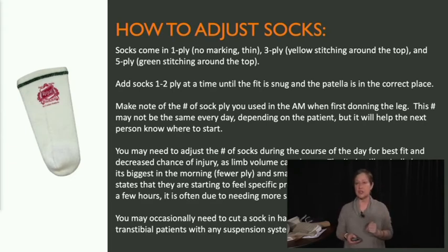This kind of gives you the overview, and you might have your own sock management handout for patients. I would suggest that you get the handout from your local provider, because the patient comes to you for their outpatient therapy session, and you say, what did they teach you? And they say, I don't remember. And well, what about your handout? I left it at home. Here it is, I happen to have one. Because you're going to be reinforcing what the prosthetist told them, and you want to make sure that you don't throw them for a loop, and you guys are really speaking the same language. I think that's really important.